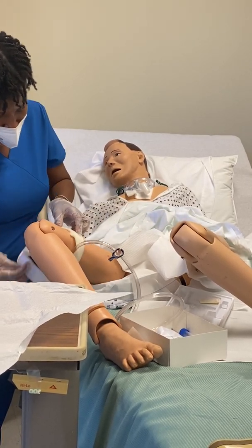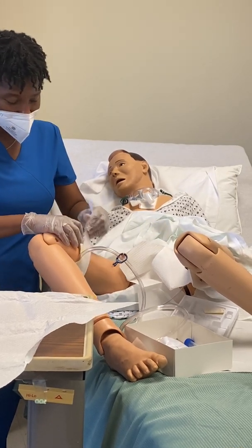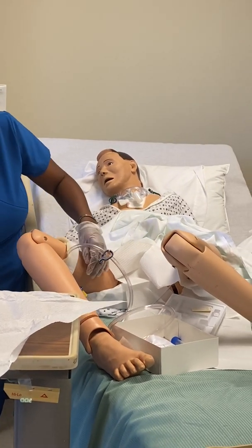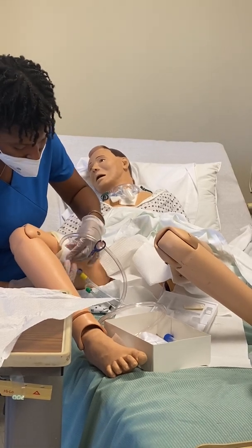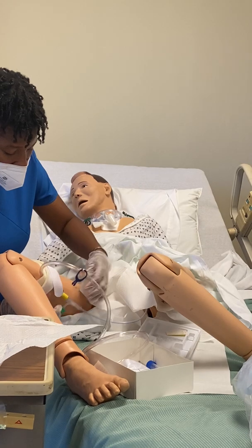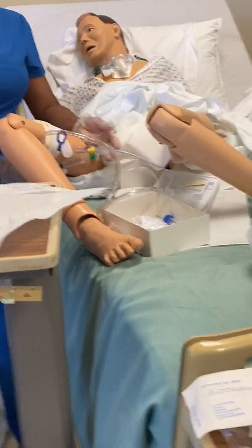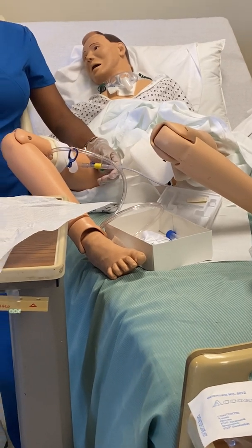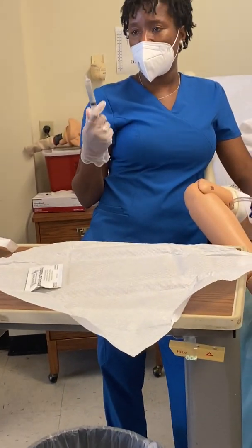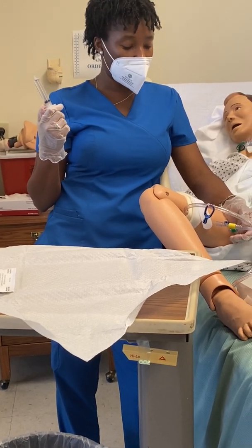We got this all backwards, but we're going to make it work, y'all. Just don't leave it on your patient really like this. And then it goes in a little flap. Yeah. That's here. You just put the catheter through that like that. I'm going to show y'all the real way to do that when we get through. This, and you can disconnect your syringe, okay? Because you don't want it to come back out at you like it did at me. So once you get it in there, you disconnect your syringe.